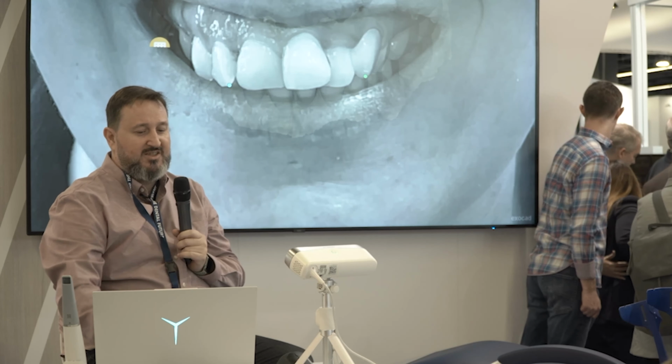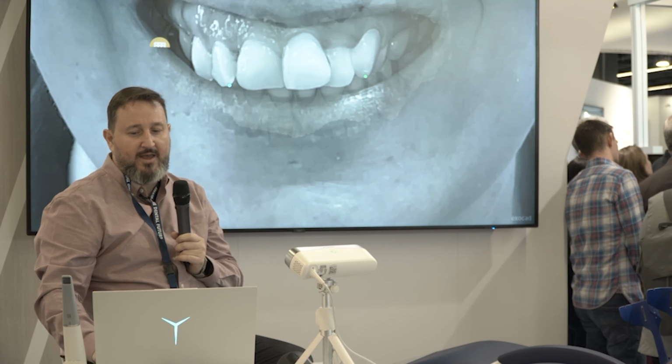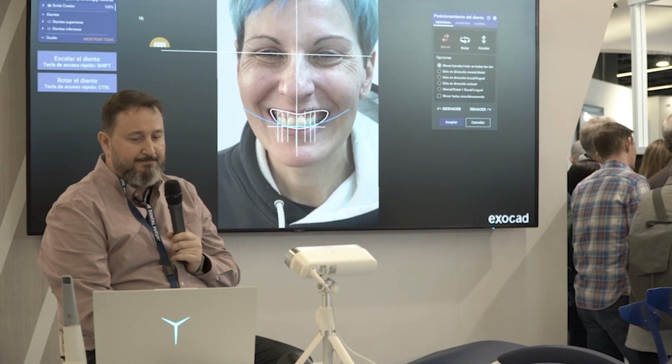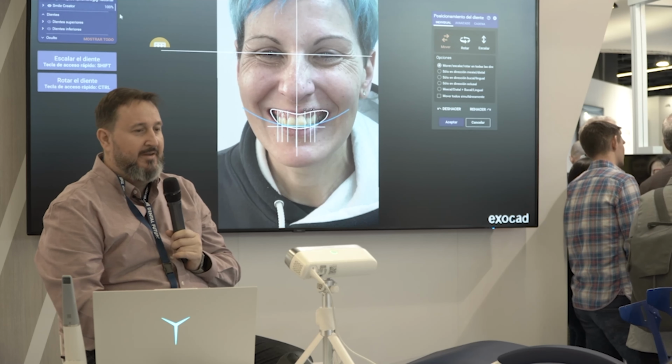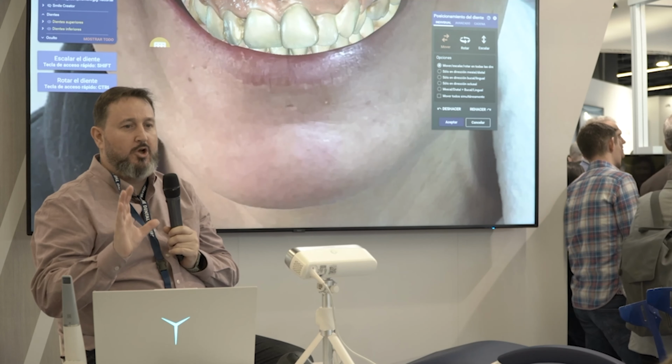So now you can see we use the points. This is Dental Smile Creator in Exocad. We trace the lines, and here's what happens. Okay, let's see. This is the Smile Creator lines, and see what happens when we overlay these jaws. Okay, at the moment it looks okay.